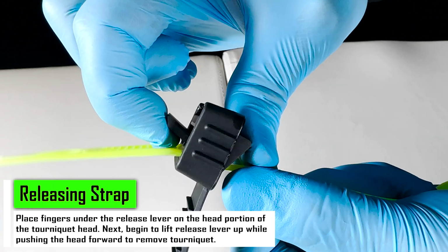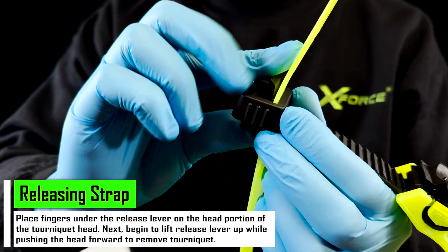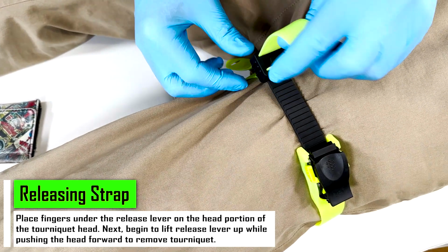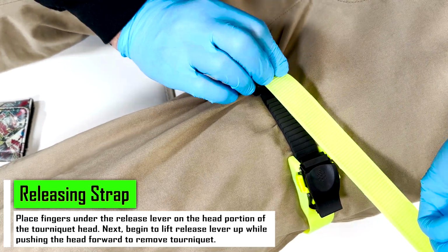Releasing strap. Place fingers under the release lever on the head portion of the tourniquet. Next, begin to lift the release lever up while pushing the head forward to remove the tourniquet.